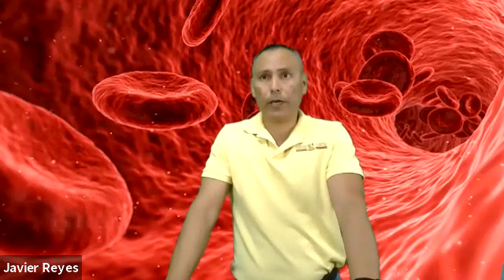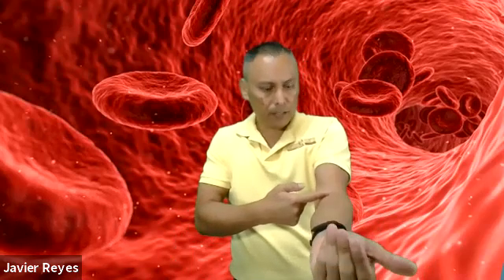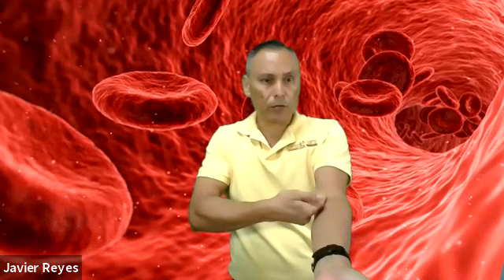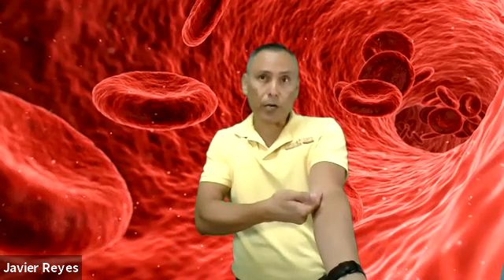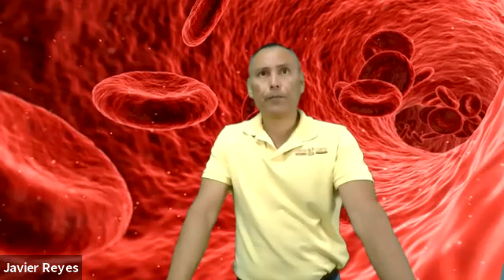That is not acceptable. The needle bevel against the upper wall of the vein prevents blood flow. When you insert into the vein, especially in the antecubital area, if the arm is bent a little bit, the bevel may end up hitting the top wall of the vein and getting blocked, and you might not get blood return. So make sure that the patient has a straight arm. If you then see blood flow, that was the problem. If not, you might have to come back out just very slightly, without taking the needle out.